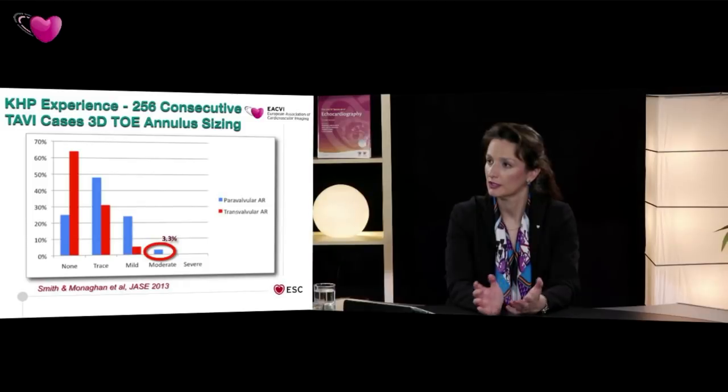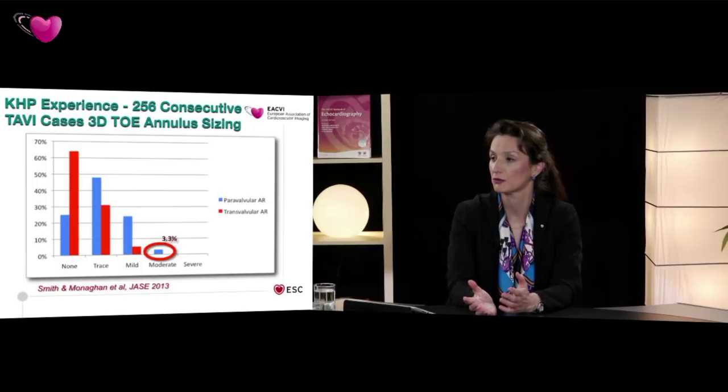That's very important. In your institution, in your center, how do you approach these patients? Do you check, for example, the different anatomy that we can have, whether they have a raphe or they only have the two leaflets? Yeah, I think in some ways that is a controversial part of my case that I skipped over a bit. But I think it's controversial for two reasons. Like TAVI and bicuspid valve patients, I think we pause a little bit. I think you can do it, but we at least pause when we're dealing with the bicuspid valve.